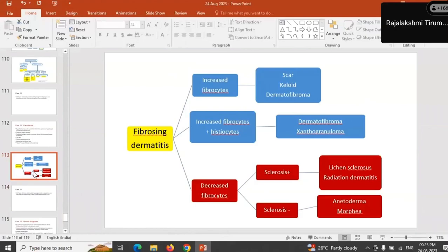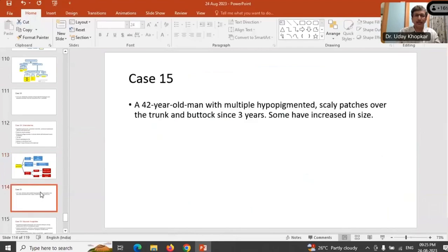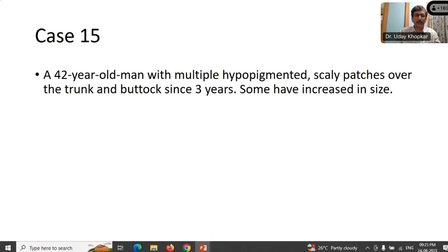Just a brief comment about the erythema nodosum. Sometimes it is not always nodules; it may be a plaque on the legs or even at other areas when it is the migrans variant. Histopathology is the same. And as far as the scleroderma case is concerned, localized scleroderma or morphea is much more common as compared to systemic sclerosis.